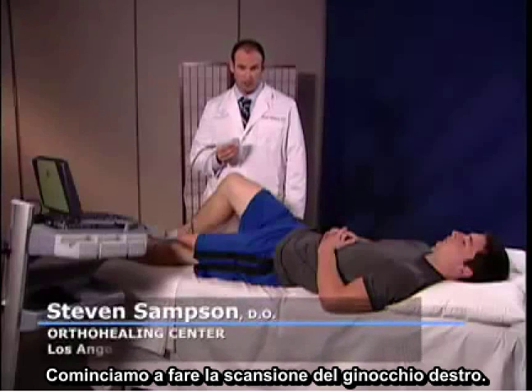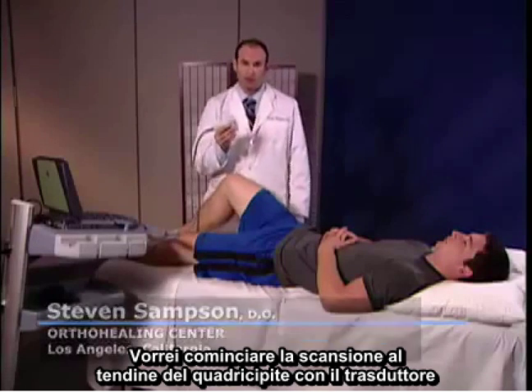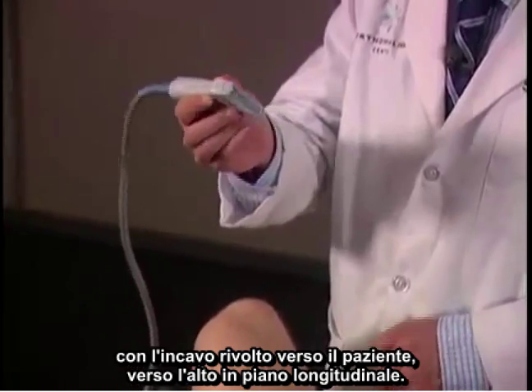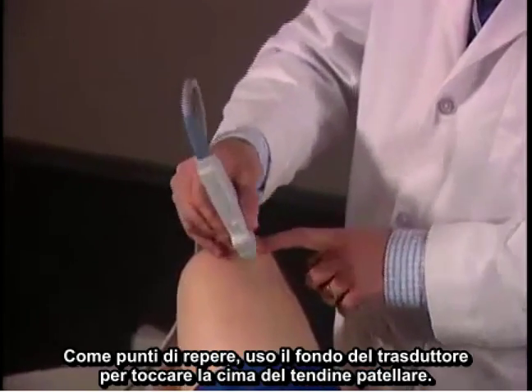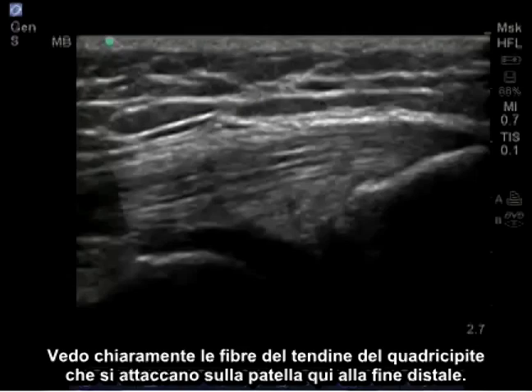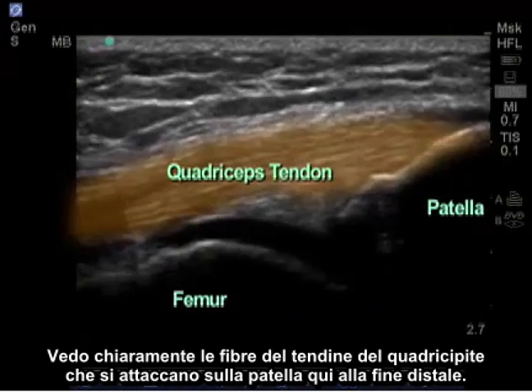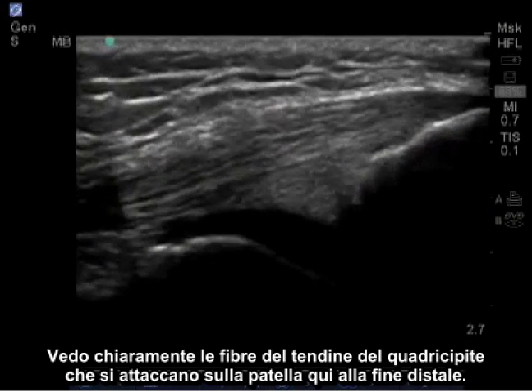We're going to begin scanning the right knee. I like to begin the scan by starting at the quadricep tendon with the transducer with the notch facing towards the patient upwards in a longitudinal plane. As my landmarks, the bottom of the transducer is touching the top of the patella. I can clearly see the fibers of the quadricep tendon attaching on the patella here at the distal end.